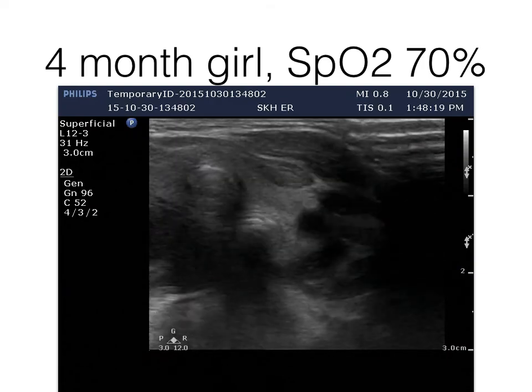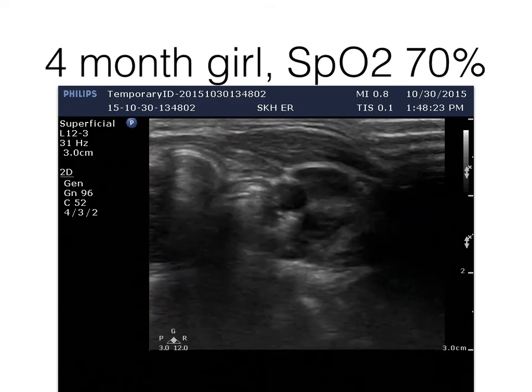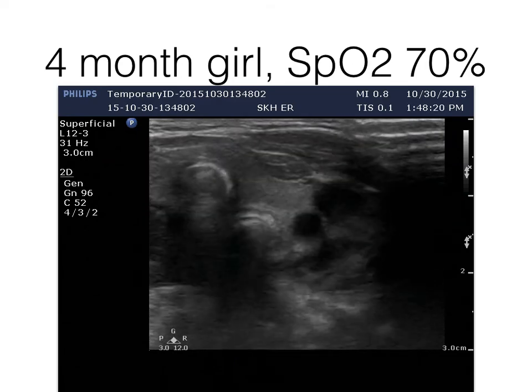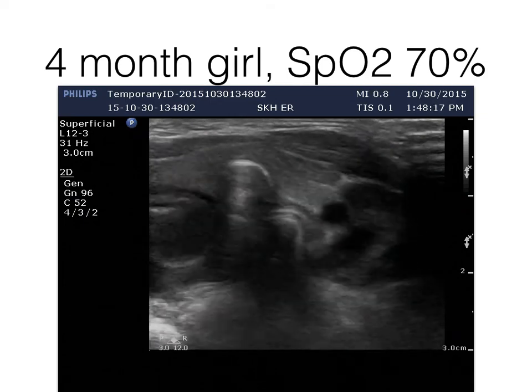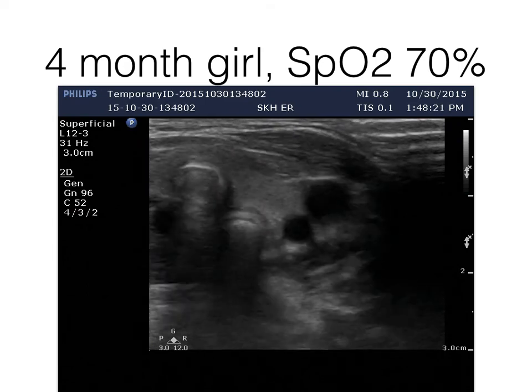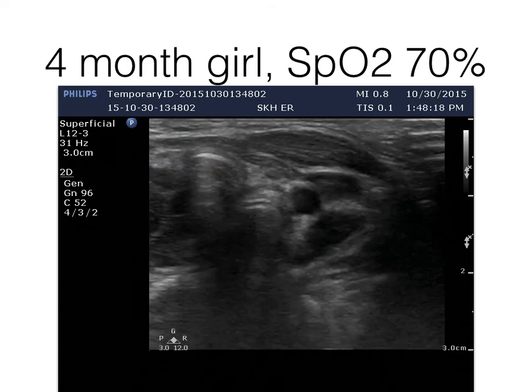Is the intubation in correct position or not? Right? Why? Because we can see double track, right? See the double track. So no more bagging. Just pull the endotracheal tube away because it is in the incorrect position, not in the trachea. So we try again.